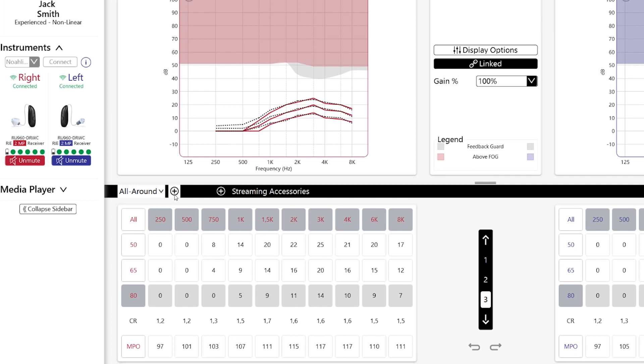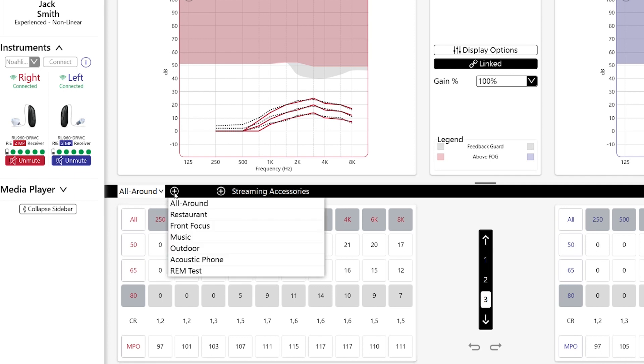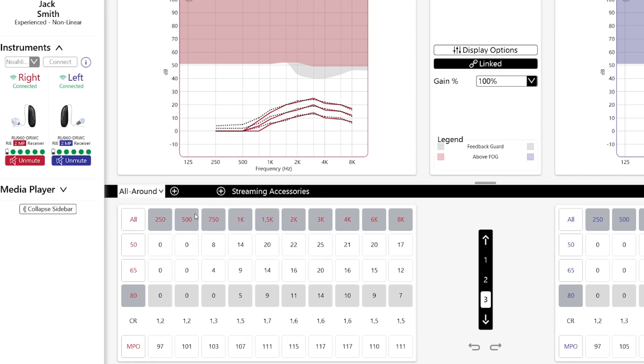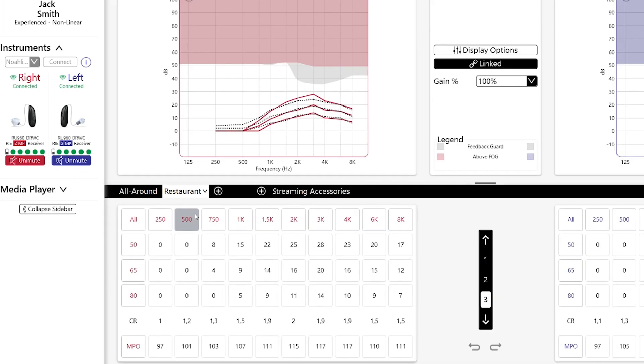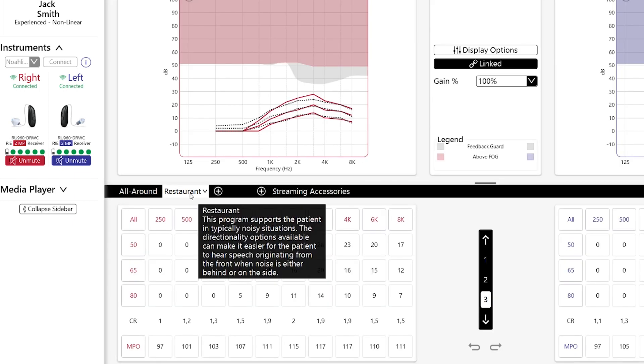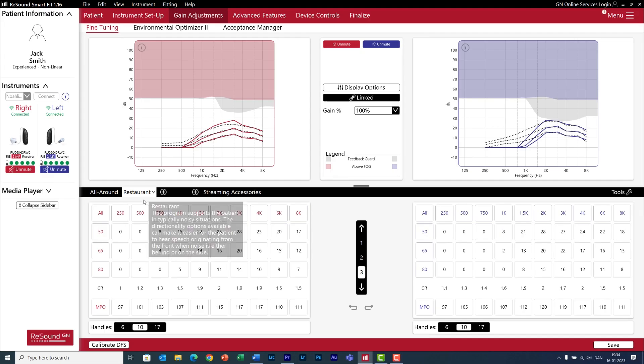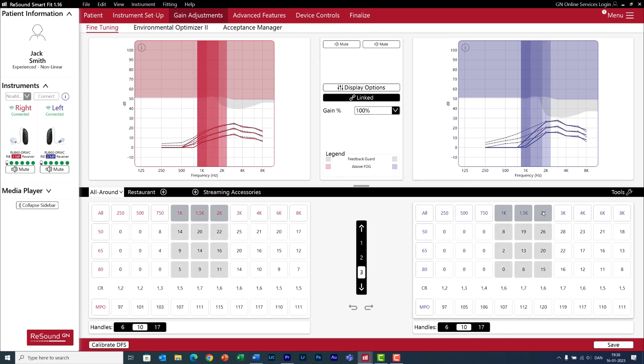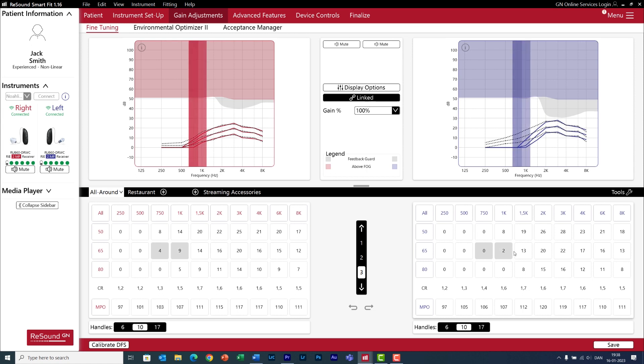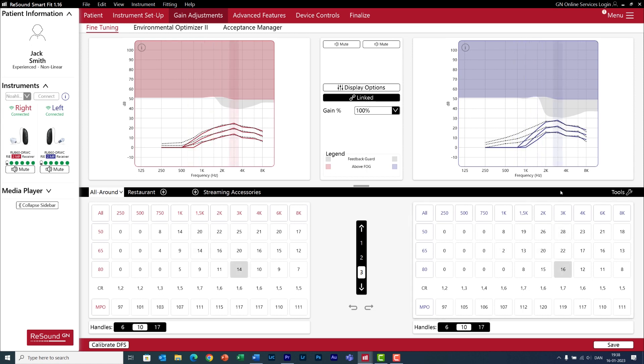Right now, I only have one program. But if you want to add more, I can click on this plus icon and select any of these predefined programs. Now, at this point, I will unmute the hearing aids and let my client hear with the hearing aids for the first time. And then I would do fine-tuning if necessary. And I will also make sure that feedback doesn't happen.